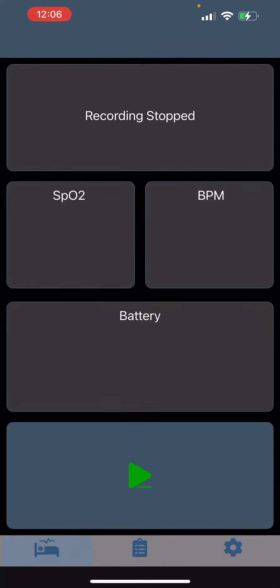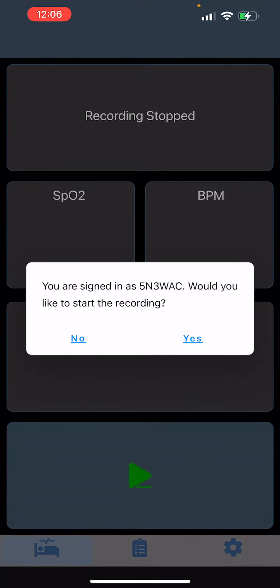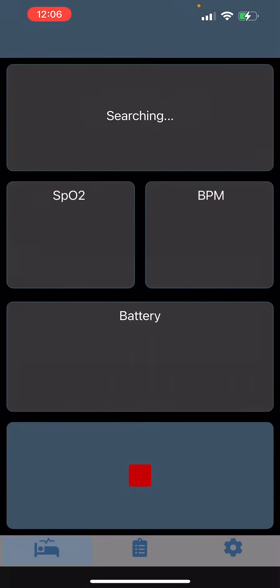Go ahead and start recording whenever you're ready to go to sleep by hitting this play button down at the bottom. It's going to ask if you're signed in - that's your patient ID. Go ahead and click yes and give it a minute to start loading your information.